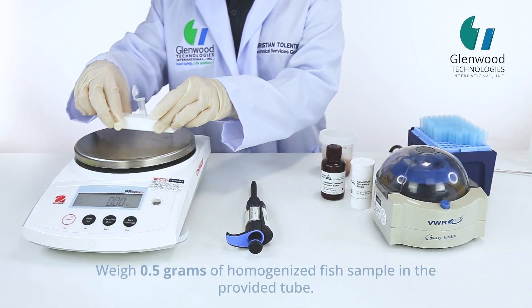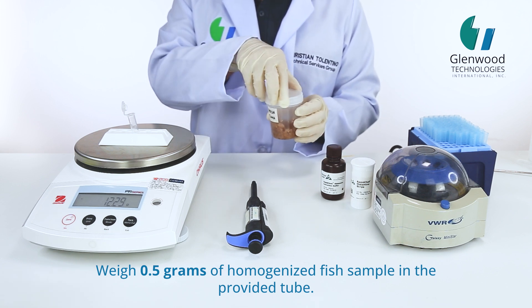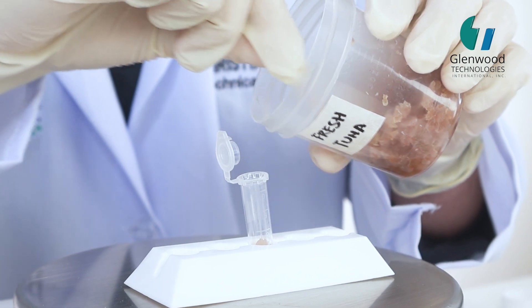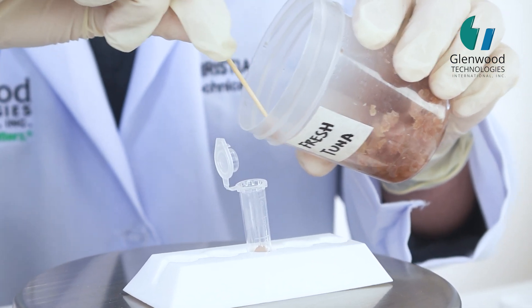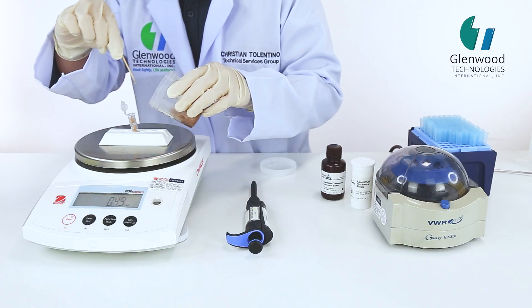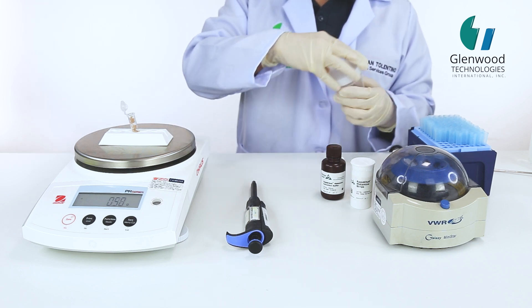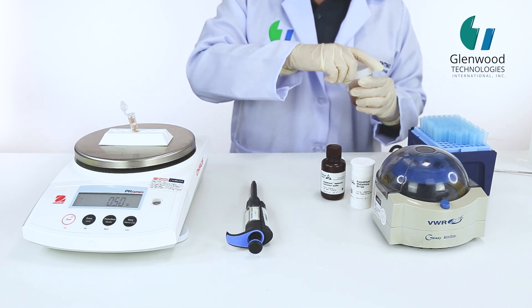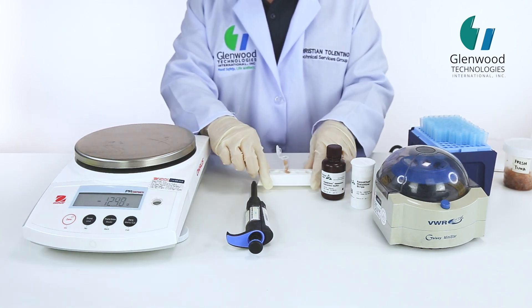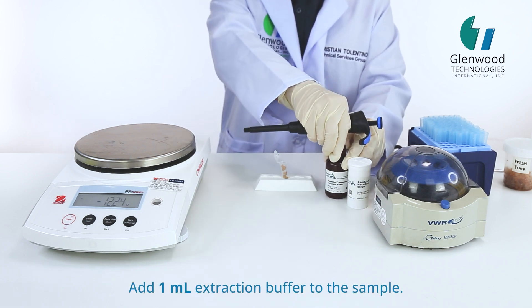Weigh 0.5 grams of homogenized fish sample in the provided tube. Add 1 ml Extraction Buffer to the sample.